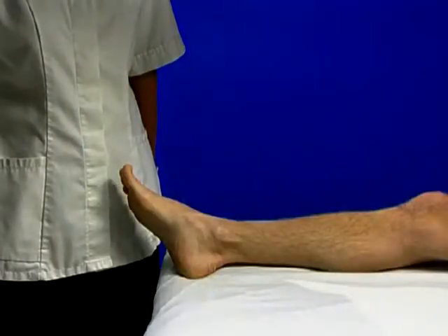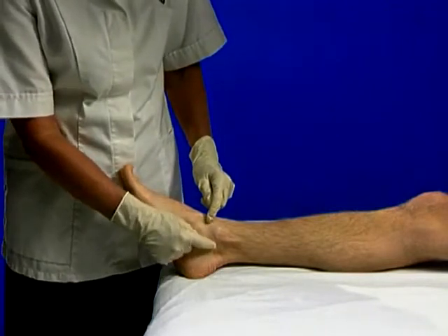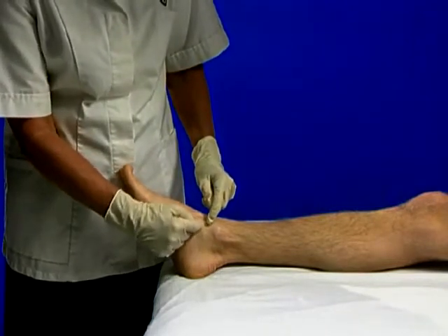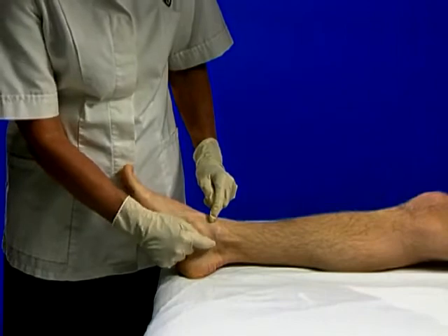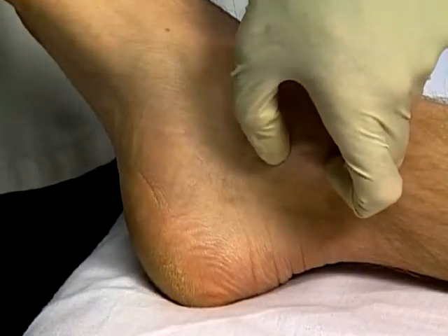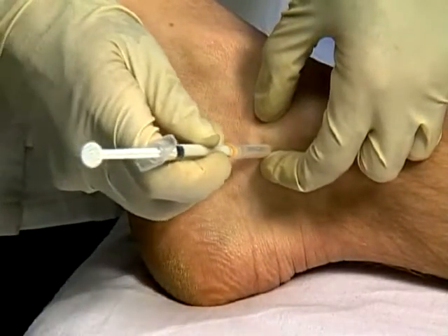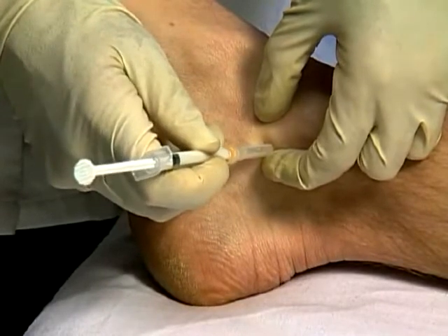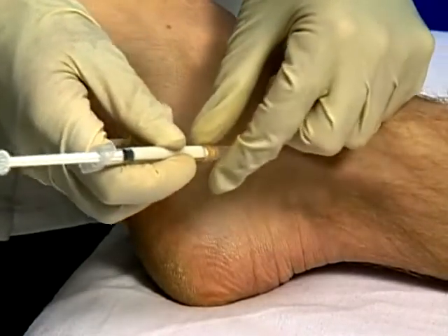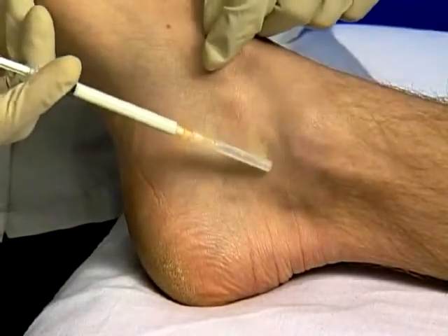The ligament arises from the medial malleolus and fans distally. It is usually affected at its origin. Mark the entry point at the centre of the tender area, clean and firmly stretch skin, and rapidly insert needle perpendicularly. Angle upwards to gently touch the malleolus. Aspirate and pepper around the origin.